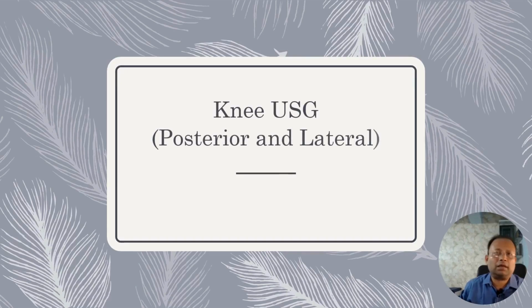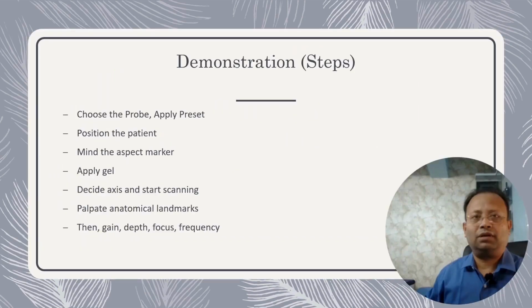So we will discuss the ultrasound of the knee, posterior aspect and lateral aspect. We shall follow the steps. So first is choosing the correct probe.